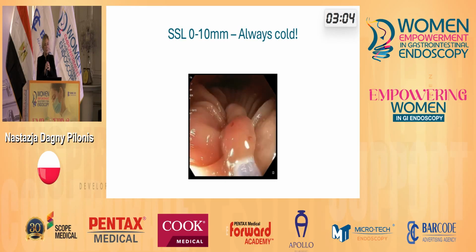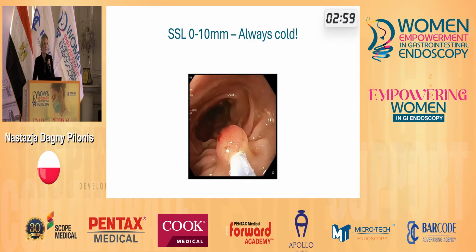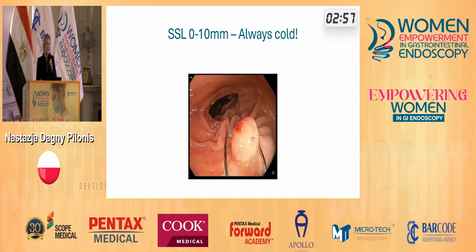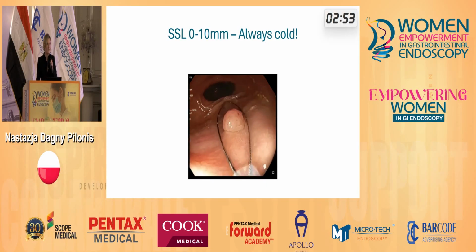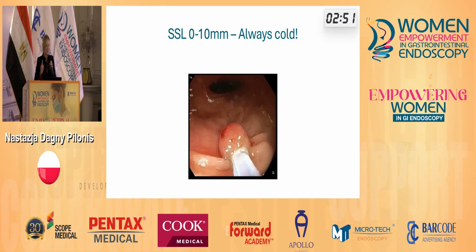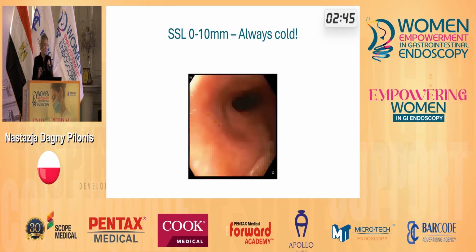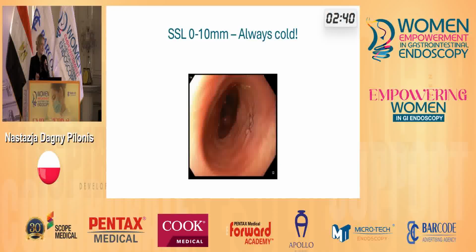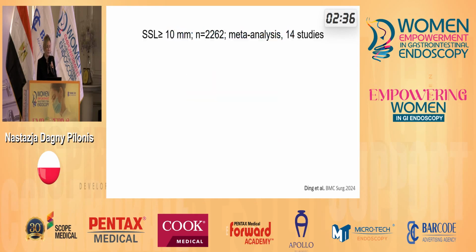In cold snare polypectomy, sometimes we have to work on this a bit more, and sometimes we even have to pull the snare into the scope to achieve this cold resection. What is more, the effect after the resection is not always as beautiful as we can appreciate after hot snare polypectomy. But don't get discouraged. This is the best way to go with those small polyps.